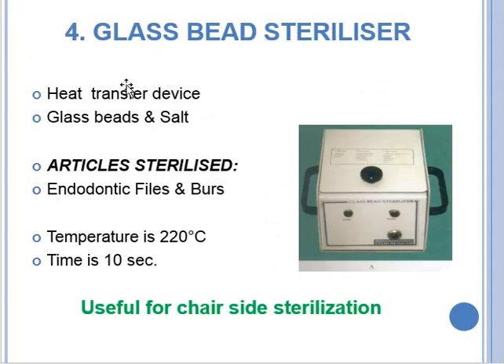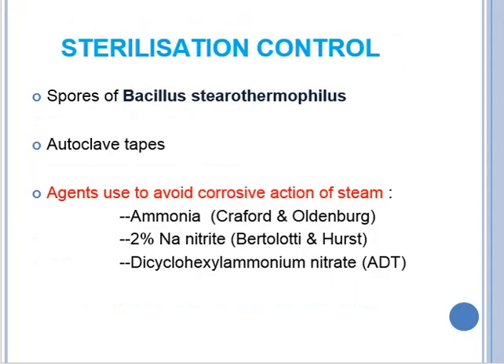Glass bead sterilizer. It is basically a heat transfer device, and glass beads and salts are used. The articles sterilized are endodontic files and burrs. Temperature set is 220 degrees Celsius and time is just 10 seconds. It is useful for chairside sterilization and used for dental equipment, dental instruments.